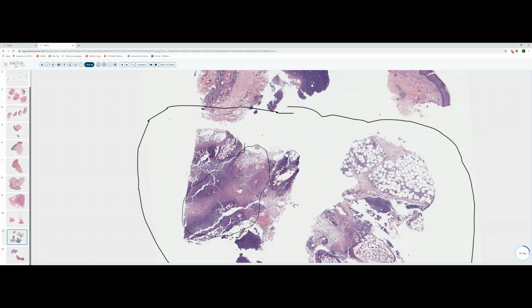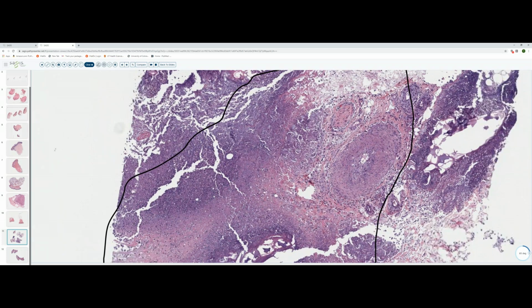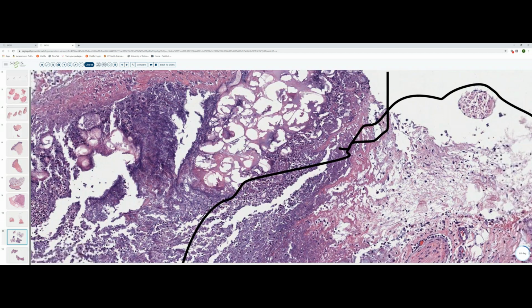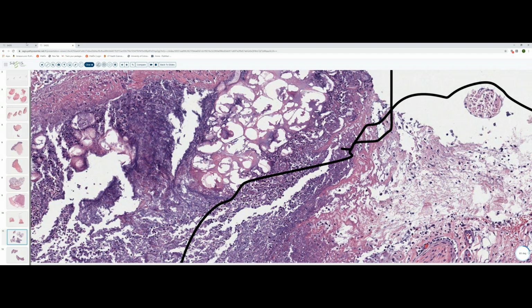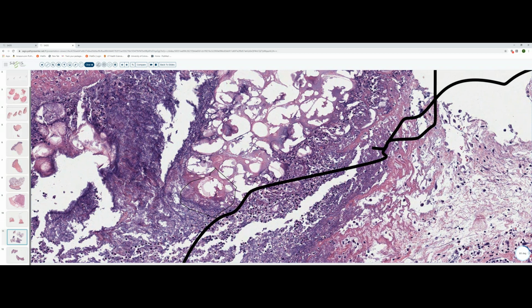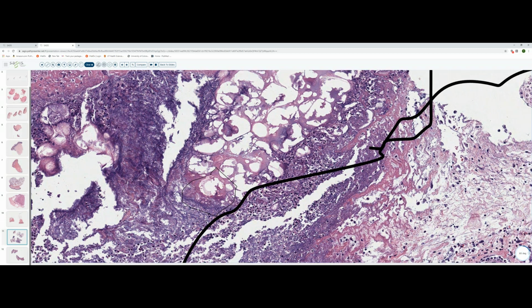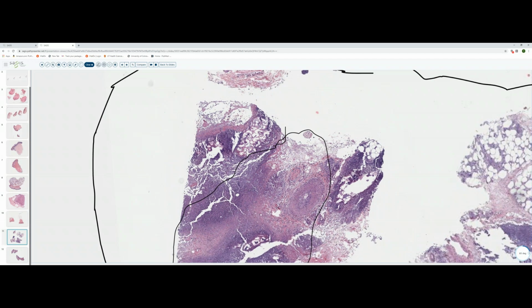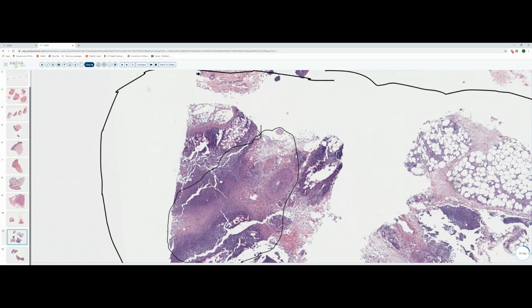Very basophilic looking, lots and lots of neutrophils here. And if we move in to this area, we can see characteristic ghost cells or necrotic adipocytes, many of which have undergone saponification. So we have these calcium salts or calcium soap deposited at the periphery of the necrotic adipocyte. This is a 4+ example of pancreatic panniculitis, and I would definitely be able to recognize pancreatic panniculitis.